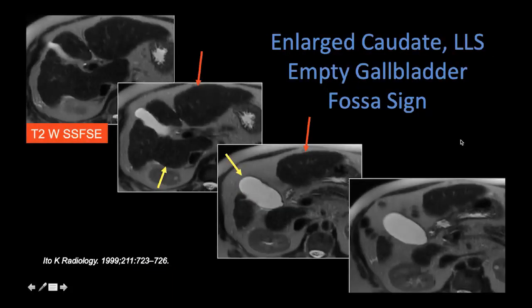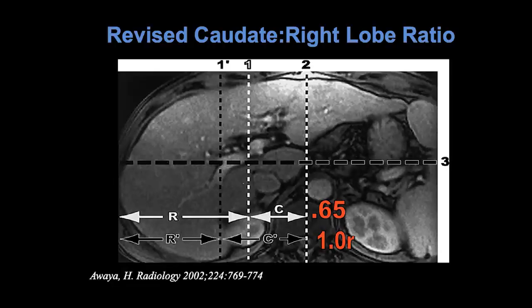Or you may see macronodular changes — large nodules or hypertrophic changes. In this case we have a large caudate, a big left lateral segment, which can often be seen nicely on a coronal image, and the empty gallbladder fossa sign, which is related to the atrophic changes of segment four and segment five of the liver. All of these are felt to be changes that develop because of alterations in portal venous flow. The revised caudate ratio can be helpful — looking at the branch pattern of the first branch of the right portal vein and comparing the caudate to the right hepatic lobe; a ratio of one or greater is helpful to tell whether the patient has cirrhosis.